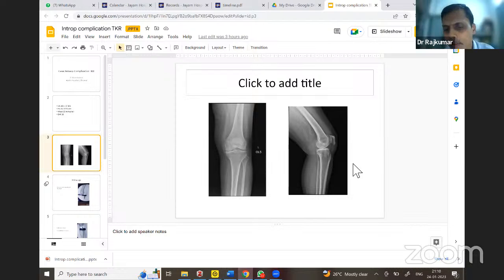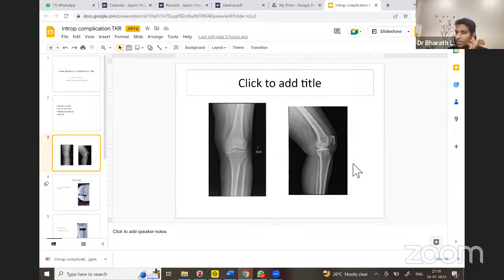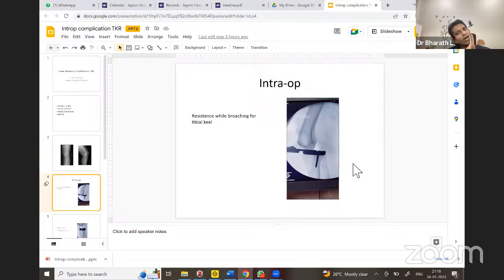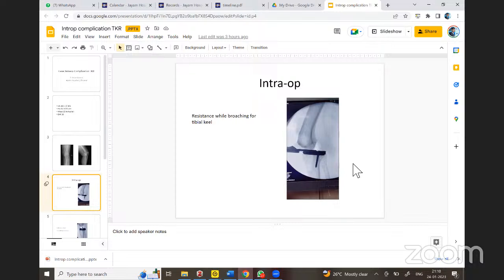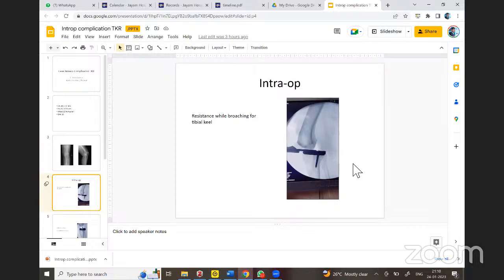The proximal tibial anterior side, the shape, I'm saying it on the C-arm picture. The C-arm picture shows the slope is a little more, it's okay, but slightly on the higher side, isn't it, Arun? Did we purposely keep it like that? Yeah, the native slope measured about 12 degrees. I planned for about 8 to 10 degrees. For a CR knee, we try to reproduce the slope, keep it as close to 7 as possible. Maybe I tried for 7 and probably went a little bit beyond.